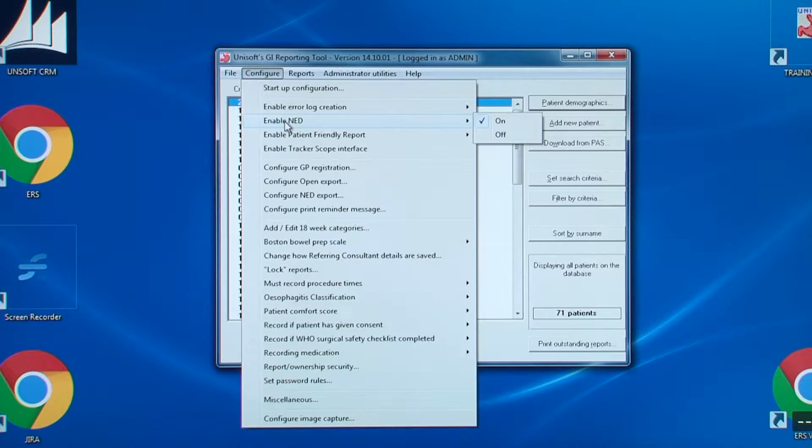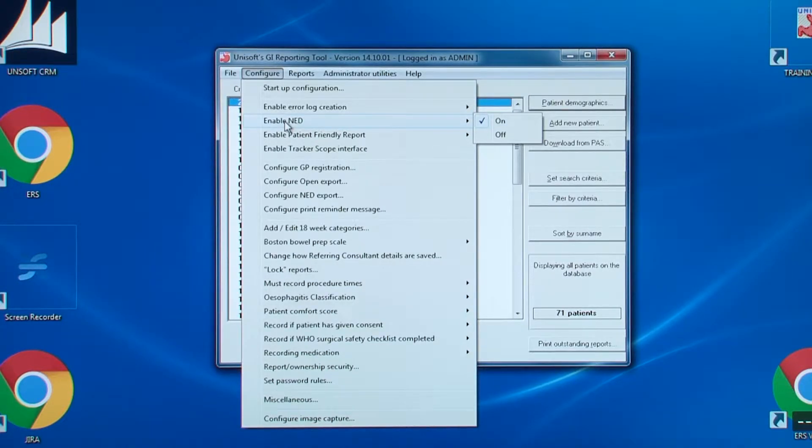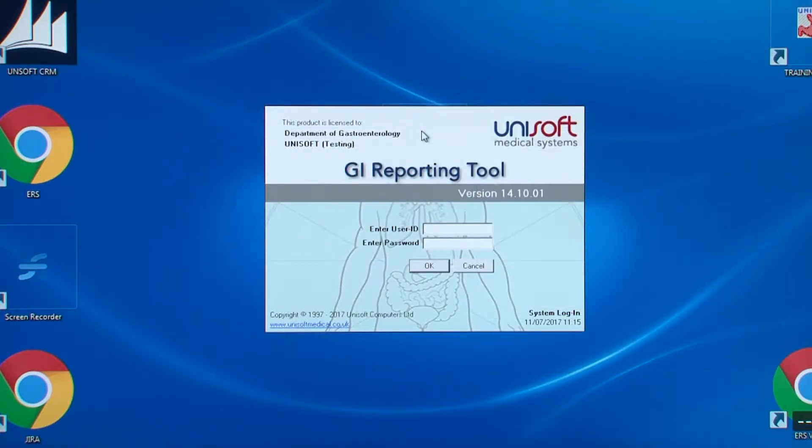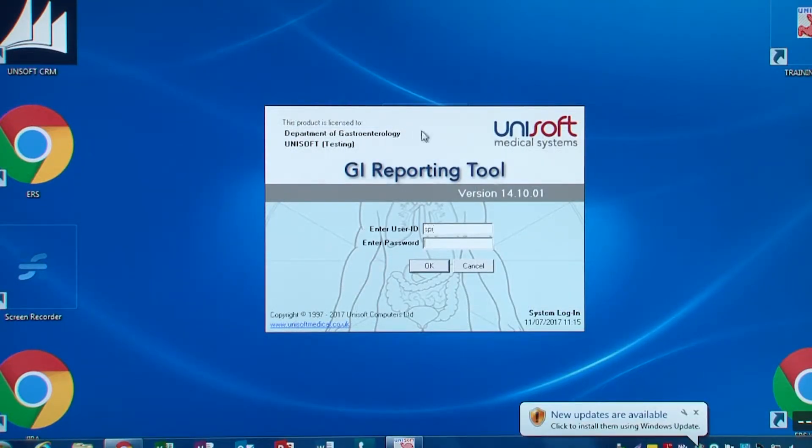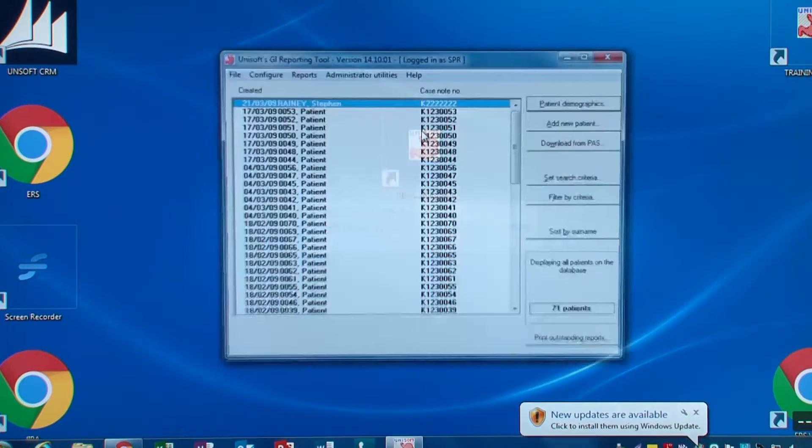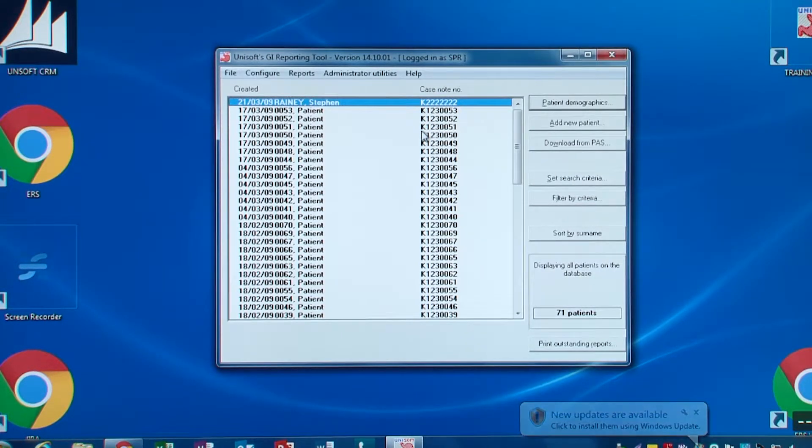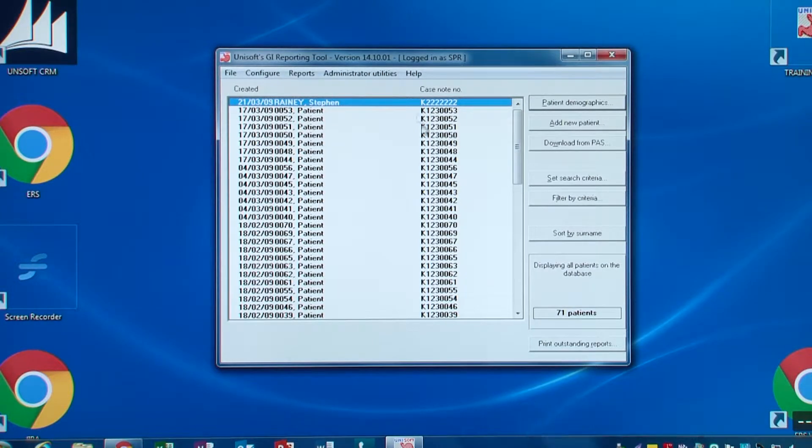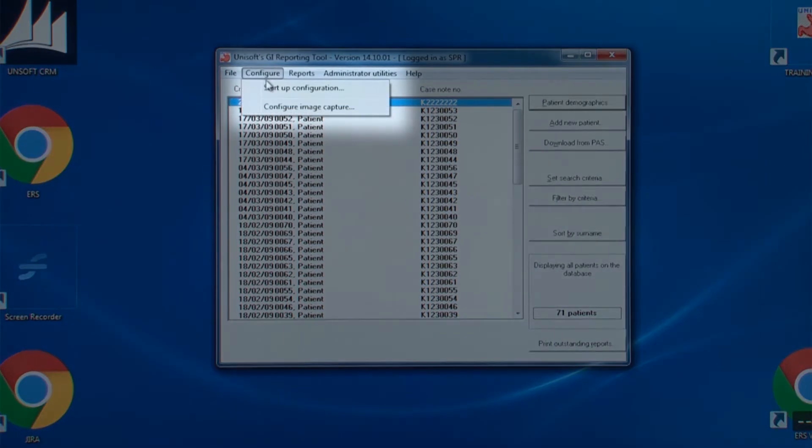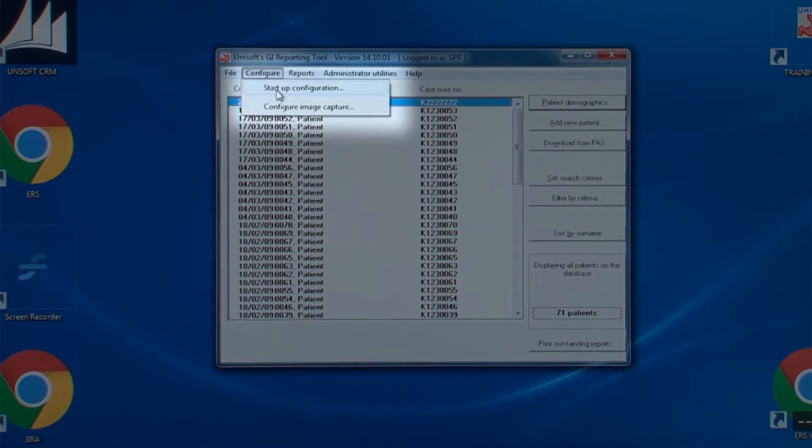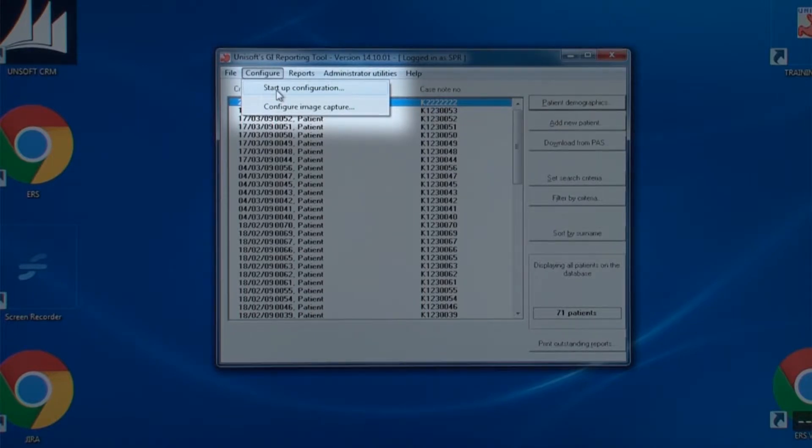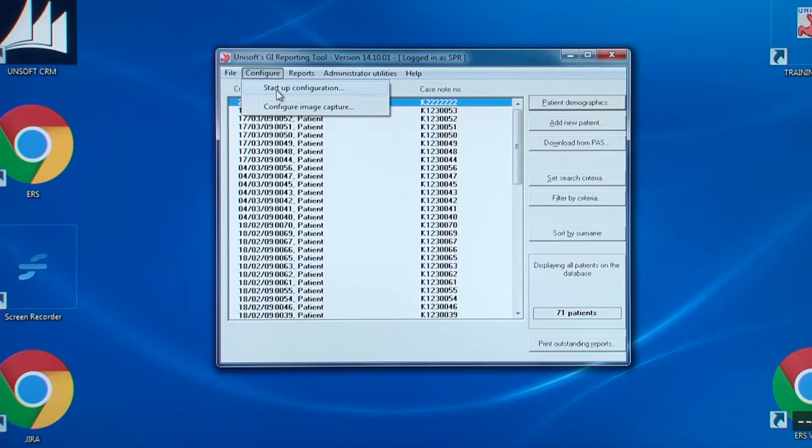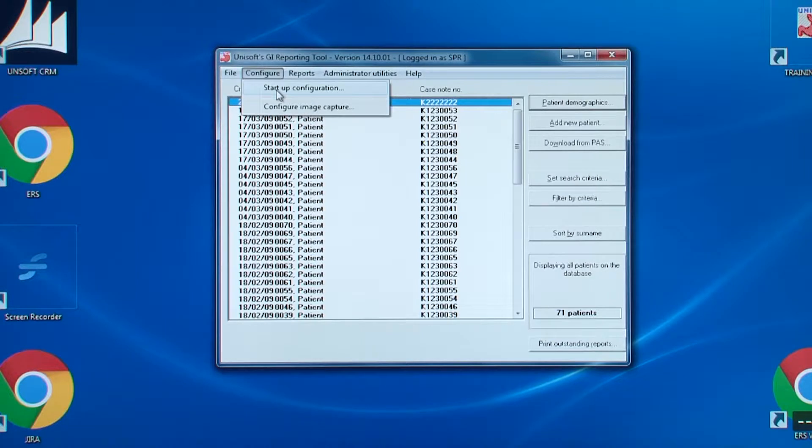So now let's look at the configure options for regular administrators. When any user logs in, including administrators, all of the main configuration options are not visible. There are just two options: the start-up configuration and the image capture configuration. We will look at the first option, in other words, how the opening screen starts up anytime someone logs in.